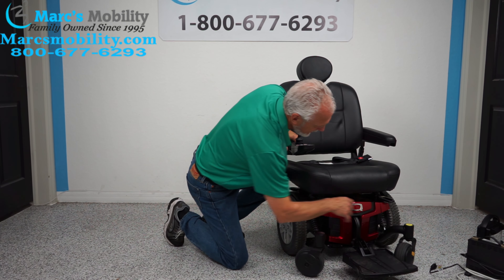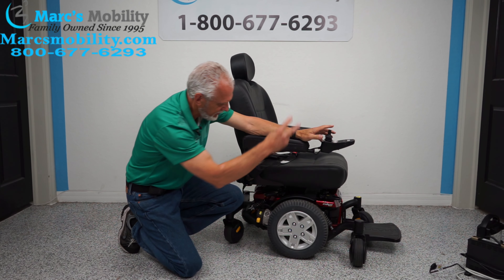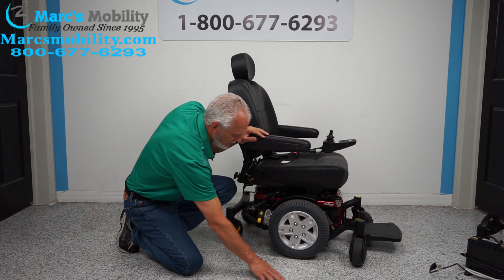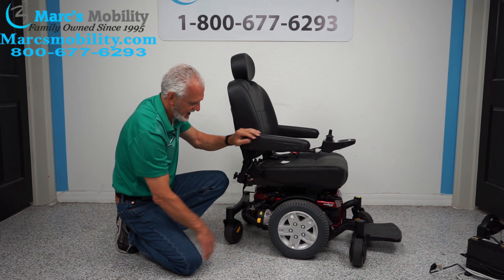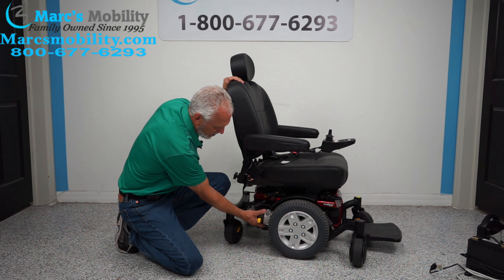You have an anchor point here and another one here, and you have two more in the back. This is where you secure your chair for transportation. So if you had to transport it, you've got one here, one here, two on the opposite side. These are 14-inch solid wheels that are not going to mark your floors — cast wheels in the back, cast wheels in the front.